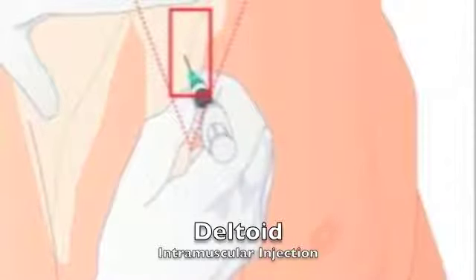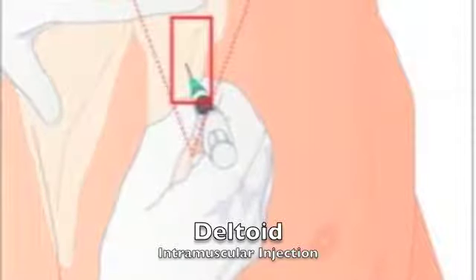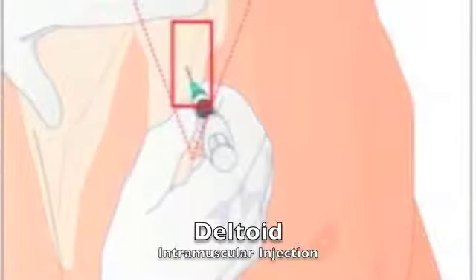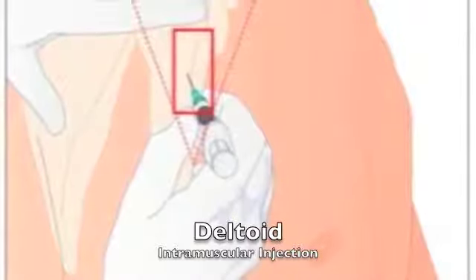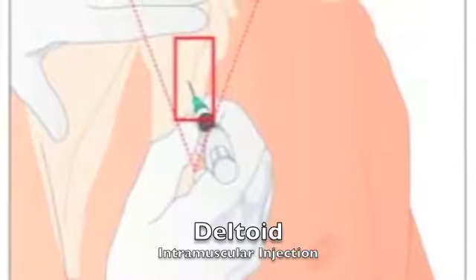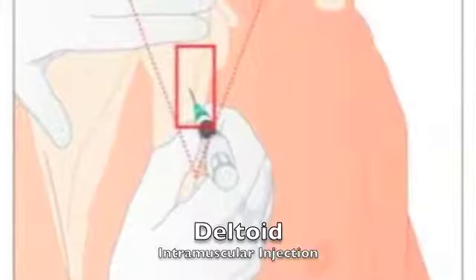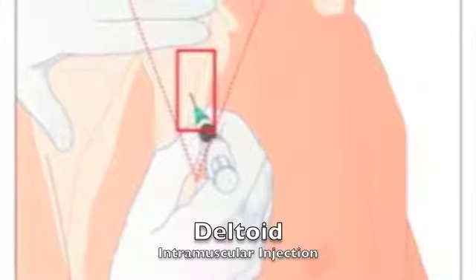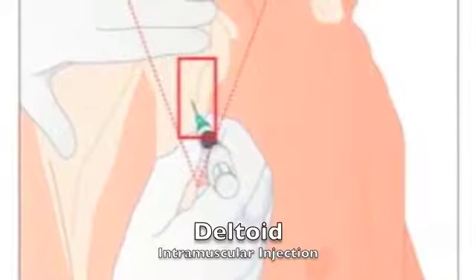You find the appropriate injection site on the deltoid by feeling the fleshy muscle of the deltoid or shoulder muscle on the side. Feel the bony prominence of the shoulder. You should be able to find that shoulder joint. The injection site is going to be about 3 to 4 finger breadths below this. Here you'll want to use a 1-inch needle, no longer.